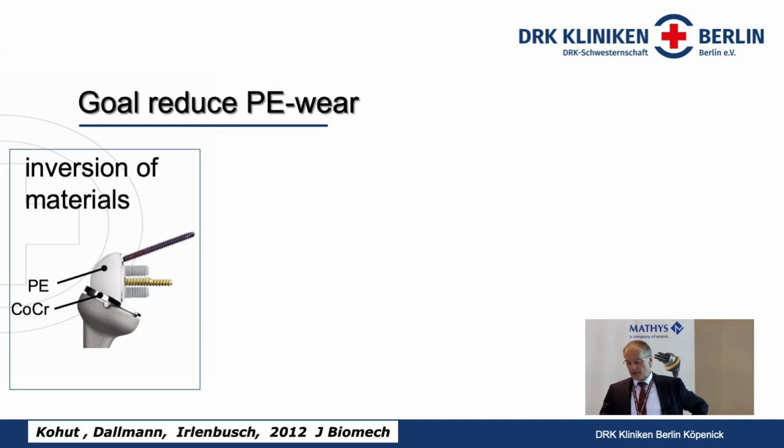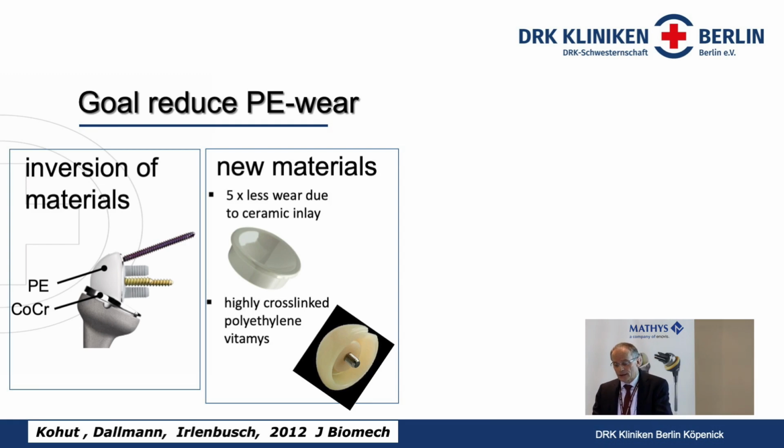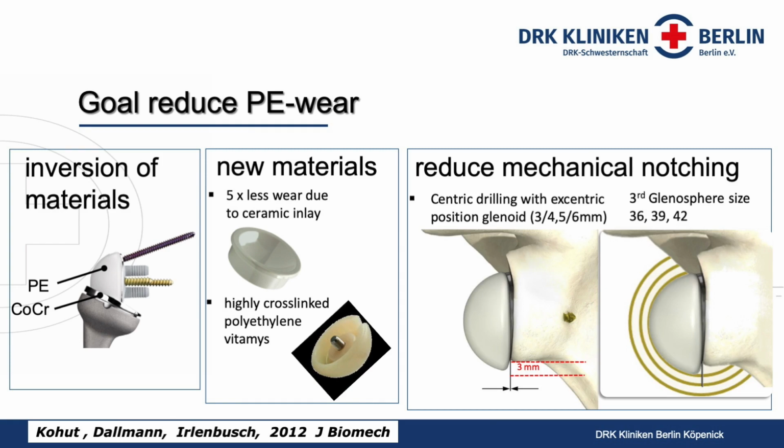Our goal in the development of this reverse prosthesis was to reduce PE wear, and for that, first we went for an inversion of the material, so we use a PE glenosphere and a cobalt chromium inlay. Later on, we got a new material, the ceramic inlay with 5 times less wear, and we have highly cross-linked polyethylene with Vitamin E. By surgical technique, we are able to reduce mechanical notching by centric drilling with eccentric positioning of the glenoid. And of course, we have 3 sizes of the glenosphere, so we get at minimum a glenosphere overhang of 3 mm, but if you use a 42 glenosphere, it's 6 or 7 mm of overhang.